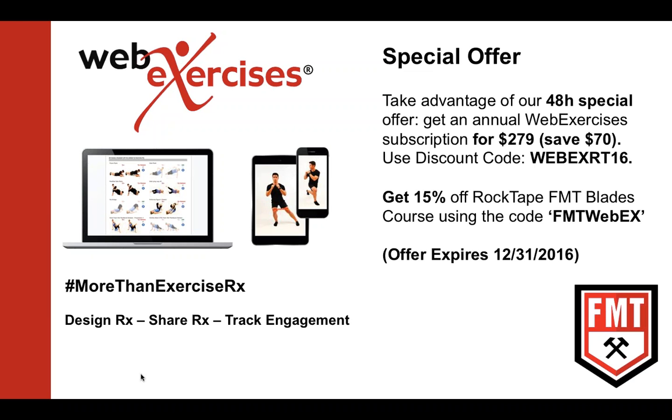Side-lying them, putting a pillow underneath their ankle, getting them as comfortable as possible, and then doing a vector directly over the area, directly over the swelling, believe it or not, very, very light, 30 seconds or to tolerance, then changing the vector, going up right over the area, then going medially and then laterally. So 30 seconds each stroke rate, and then we can move above and below along that fascial line, which is pretty much the lateral line of the body, the lateral chain.